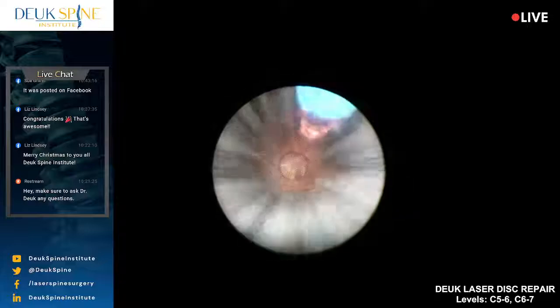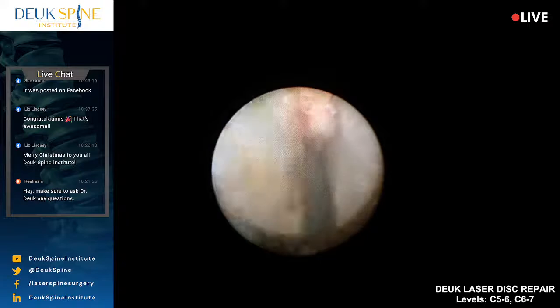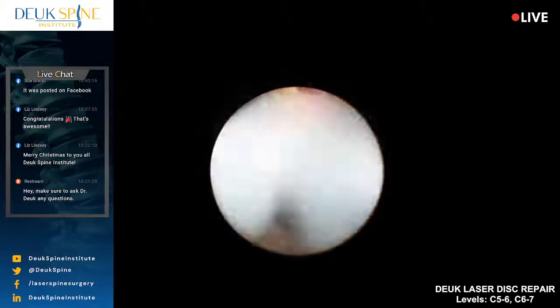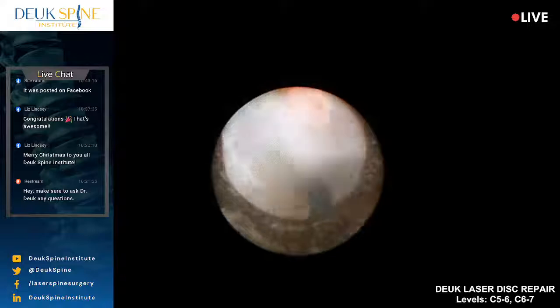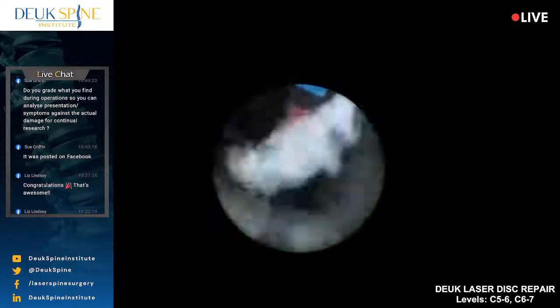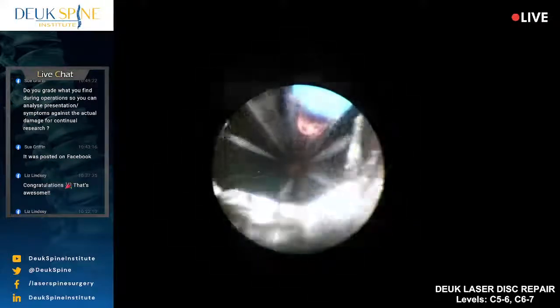Just about done. I just need this last little piece over here. There's a lot of maneuvering, by the way, of the surgeon. Maybe some of you have seen me dance in the operating room, but I have to move my body just to get the angles I need to get this stuff out. It's not easy because the patient's chest is up pushing against my hand here as I'm going in. So it's not easy for me to do this. And that's why I move around a lot. I try to leverage my weight. This is not a just stand in one place kind of surgery. It really requires that you dance around the patient.